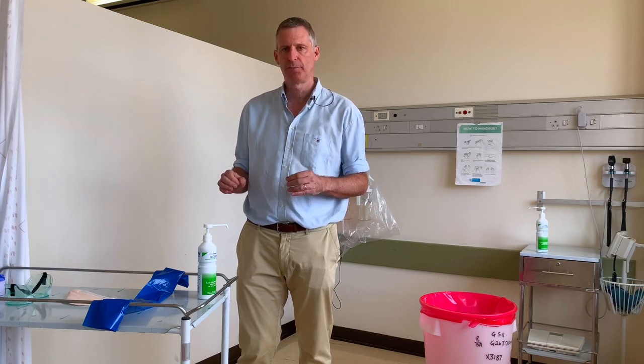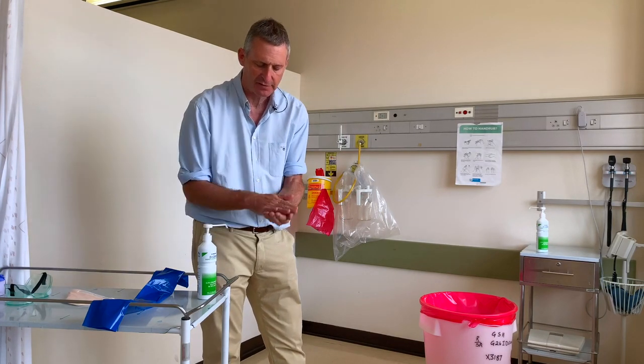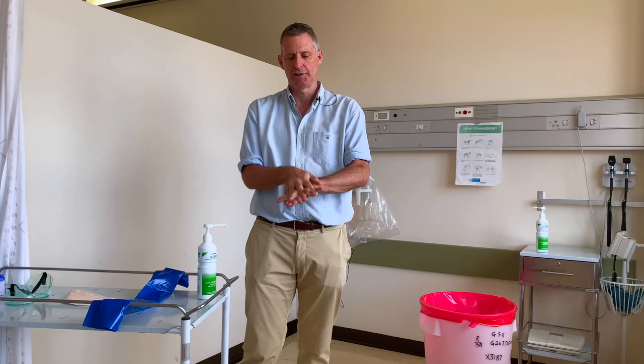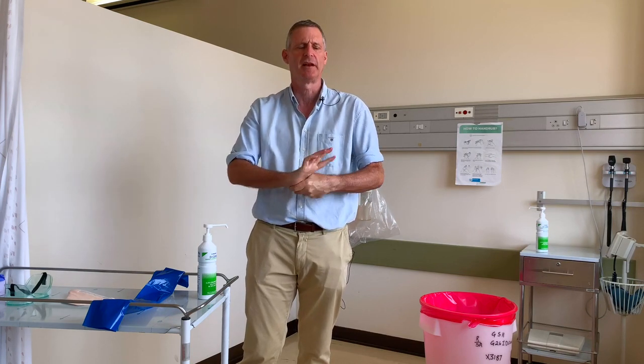For the putting on of personal protective equipment, the first thing we do is ensure that our hands are clean, so we perform hand hygiene. This can be done with soap and water — I'm going to be using alcohol-based hand rub today. We use one to three mils, starting with our fingertips and going through the stages of hand hygiene. This takes about 20 seconds — you can sing your favourite tune or happy birthday — keep rubbing until it's dry.